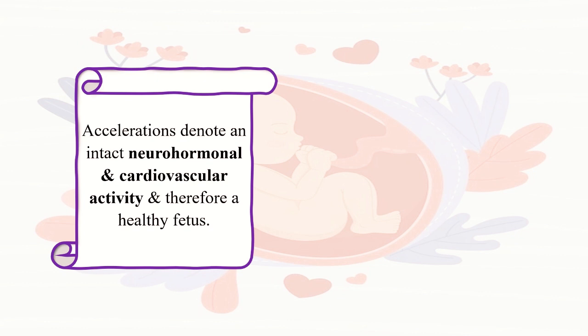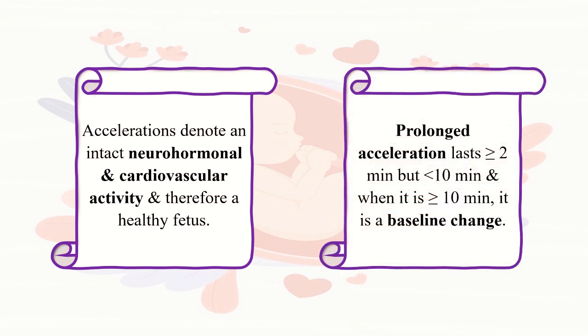But in case any acceleration is not present in the cardiotocograph, that doesn't mean that the fetus is unhealthy or the findings are abnormal. If the acceleration lasts for more than 2 minutes but less than 10 minutes, then it is considered to be a prolonged acceleration. And if the acceleration remains for more than 10 minutes, then it is considered to be a baseline change in the FHR value.